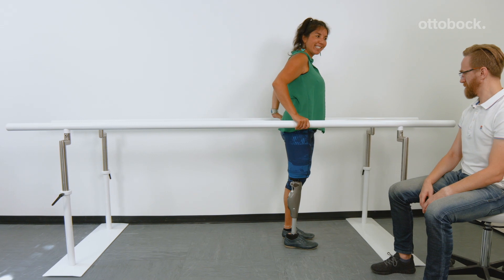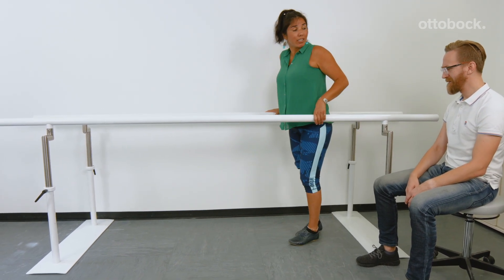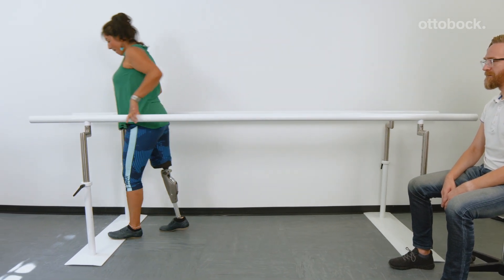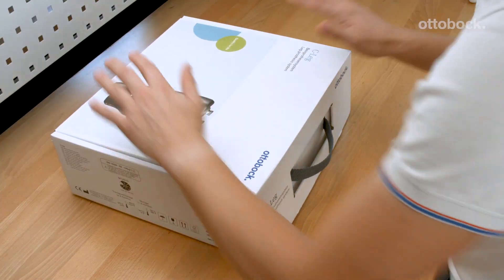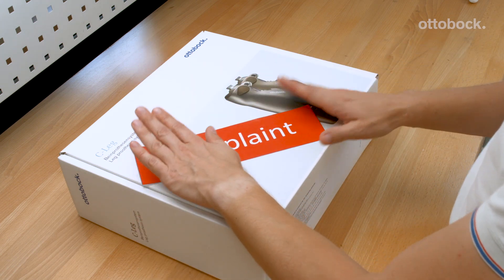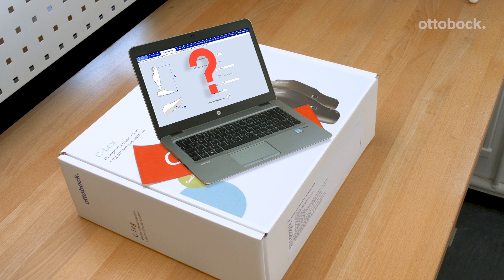The behavior shown here is not a malfunction of the C-Leg 4. It indicates that the knee joint is still at the factory setting. If the knee joint does not release into swing phase, do not return it as a defective product to Ottobock before first checking that the user data has been entered properly.